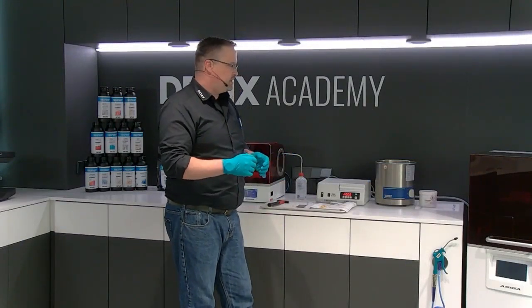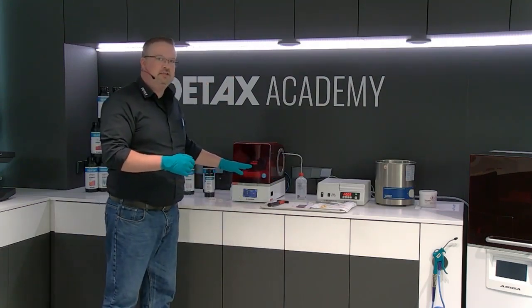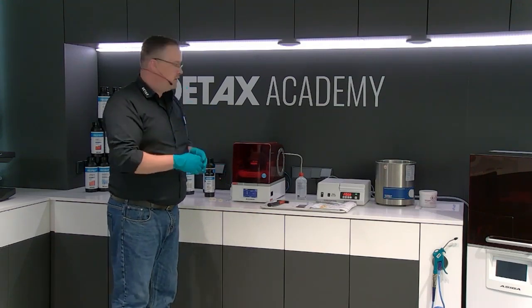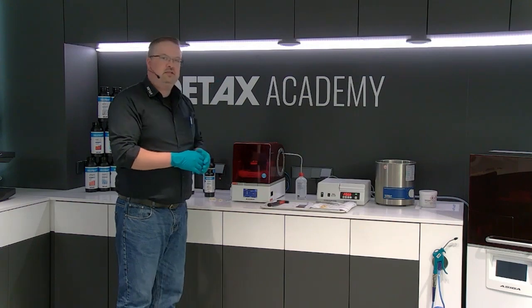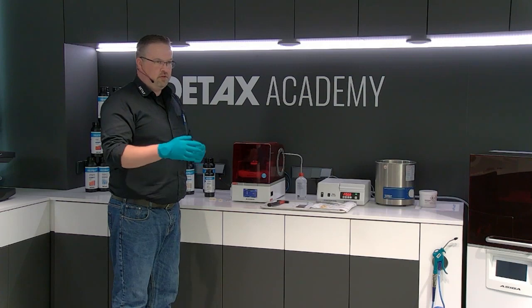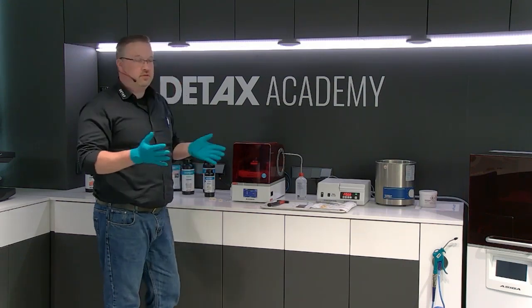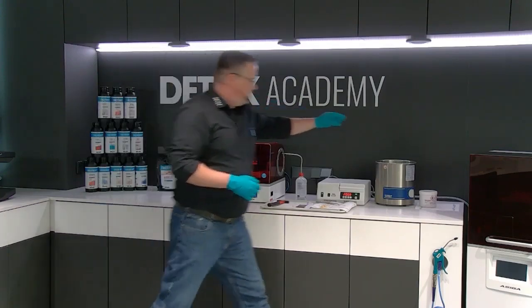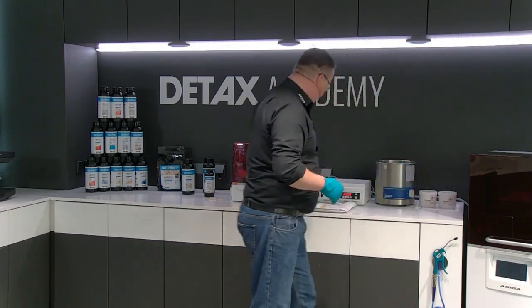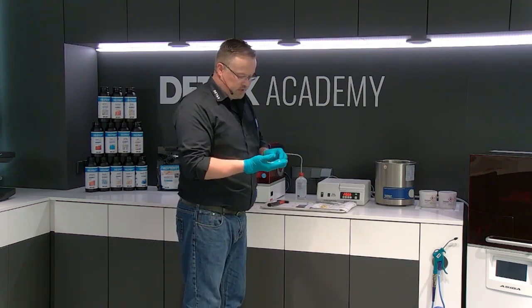Also, a big difference is our crown material. You can leave it inside the material vat, inside the printer or in the stock, but please make sure there's no UV light. 2, 3, 4 weeks is no problem. As you know, other materials will start to cure after some time. This is not a problem. Our material is really stable. After the second cleaning process, we have some really, really clean parts.